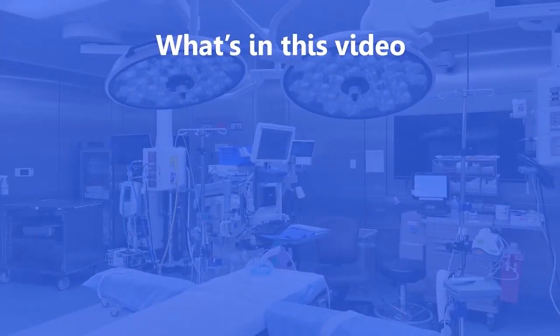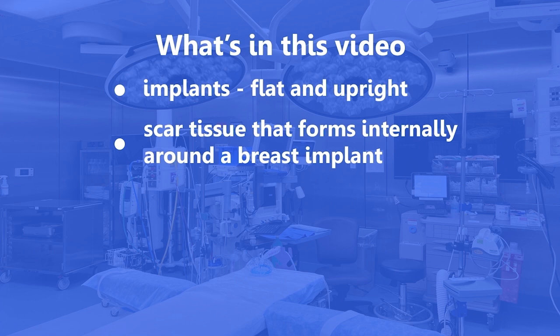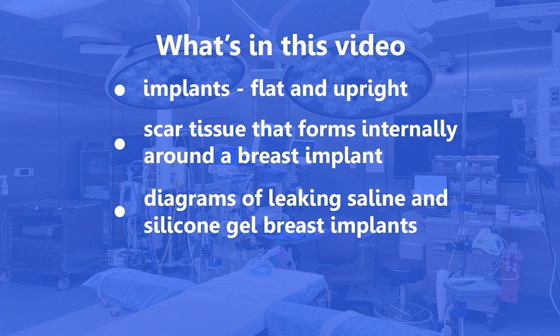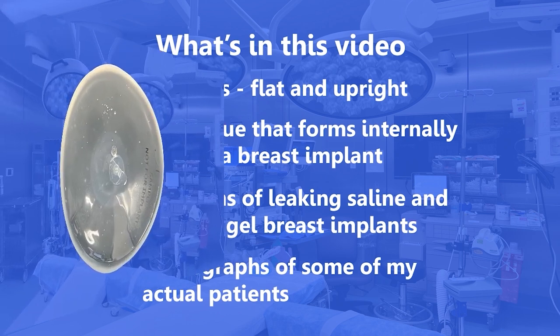To help you understand what happens when breast implants leak, I'm going to start by showing you implants in both a flat position and upright position, and why it's important that you see them in an upright position. We'll talk about scar tissue that forms internally around every breast implant. I'll also show diagrams of leaking breast implants, both saline and silicone. And finally, we'll show photographs of actual patients who've had leaking either saline or silicone breast implants.